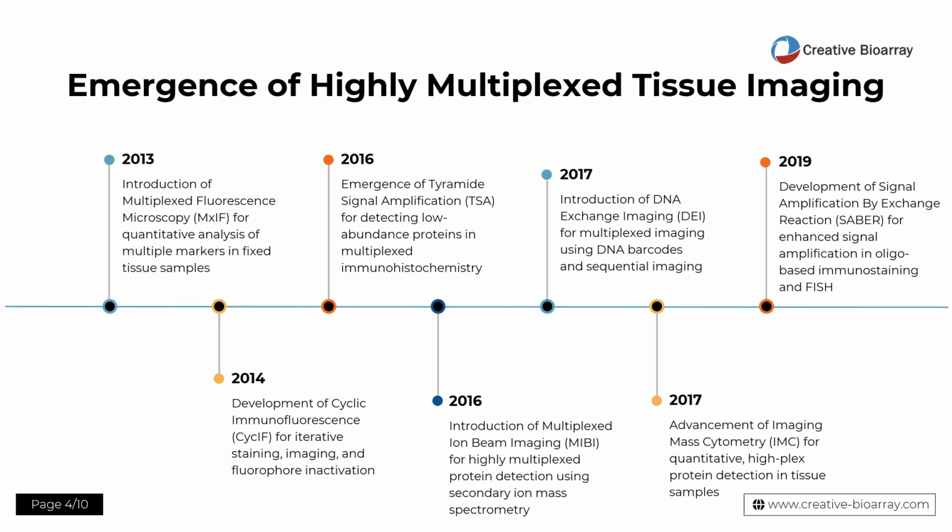A number of highly multiplexed tissue imaging technologies have also emerged, permitting comprehensive studies of cell composition, functional state, and cell-cell interactions which suggest improved diagnostic benefit. These novel imaging techniques are based on cyclic immunofluorescence, tyramide-based multiplexing IHC, epitope-targeted mass spectrometry, or RNA detection. Such techniques provide a comprehensive view of marker distribution and tissue composition, and are poised to solve major questions surrounding the pathogenesis of various complex disorders.